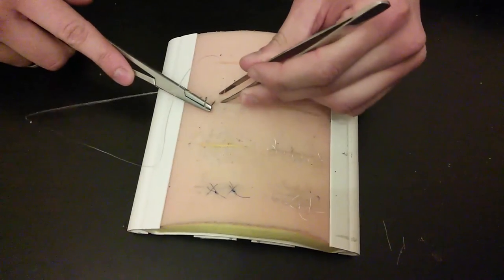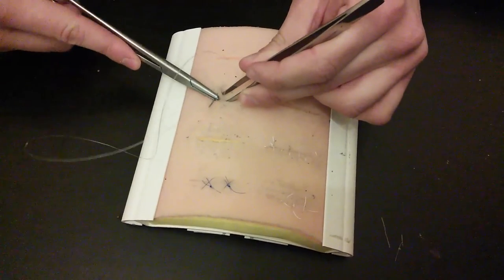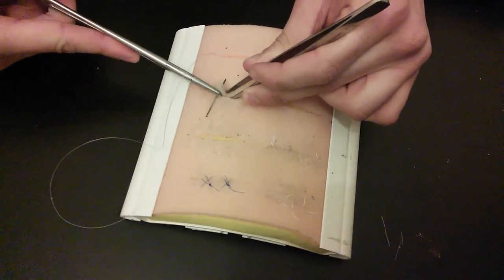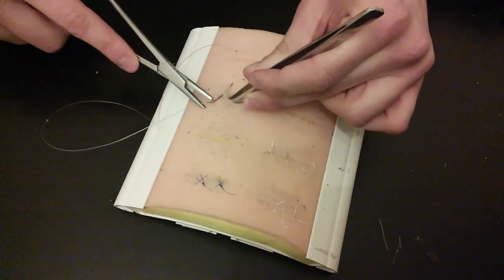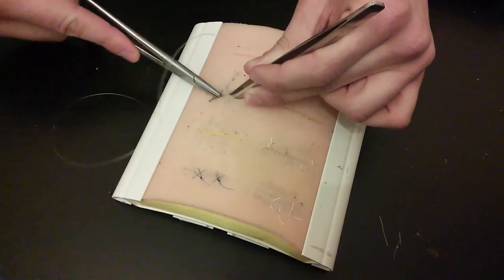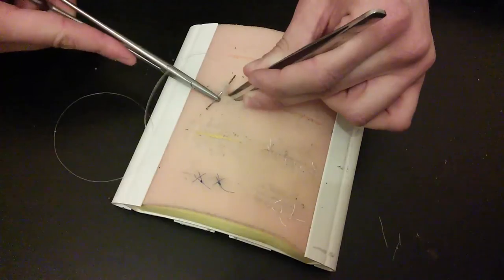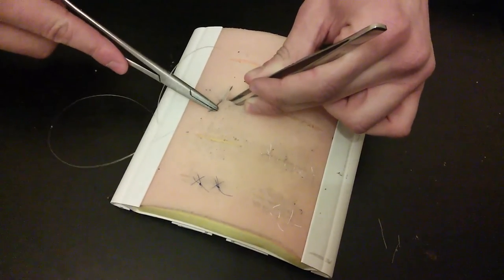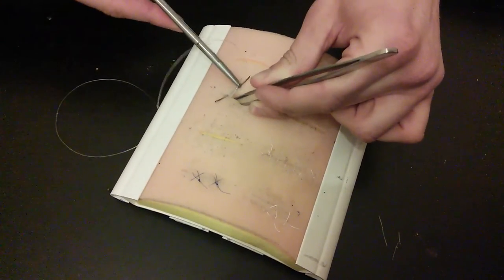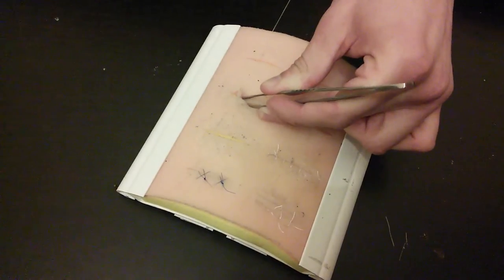Then we are going to go in again here and pull it through.